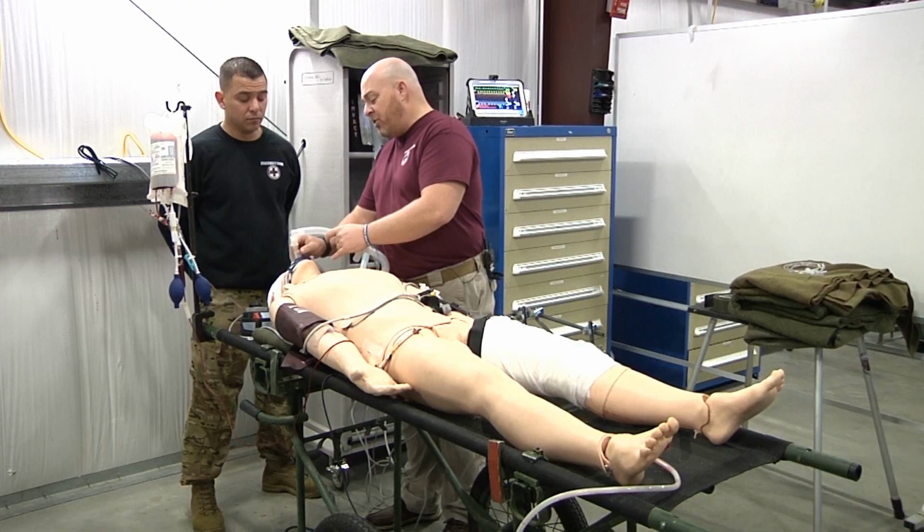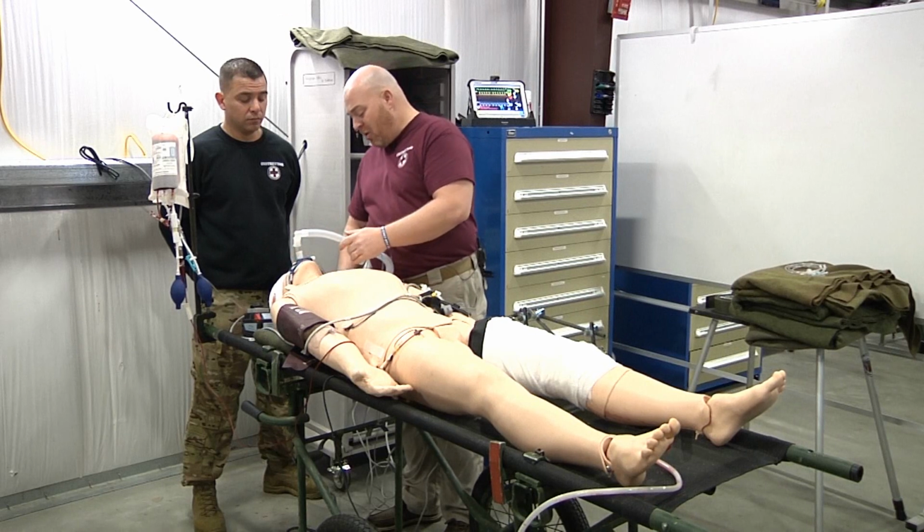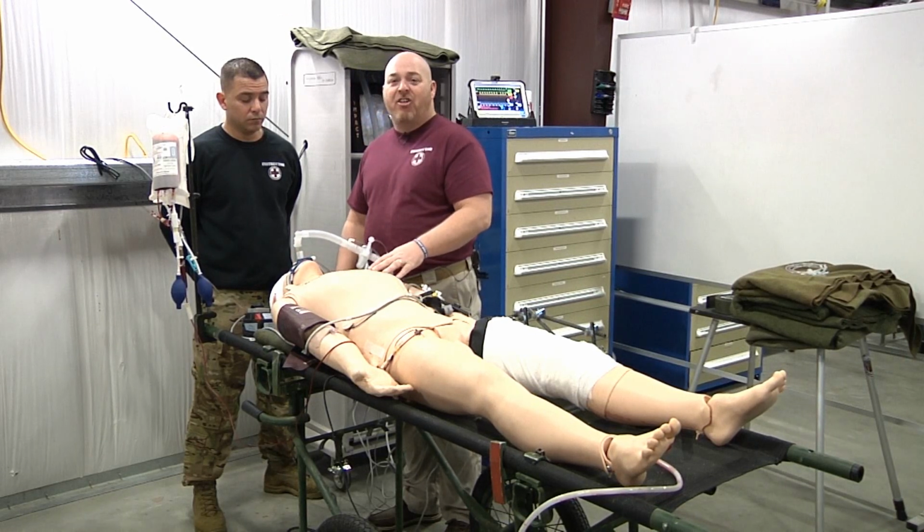All right, so after we've checked for position and security, something else that we can do is add a C-collar at this time.